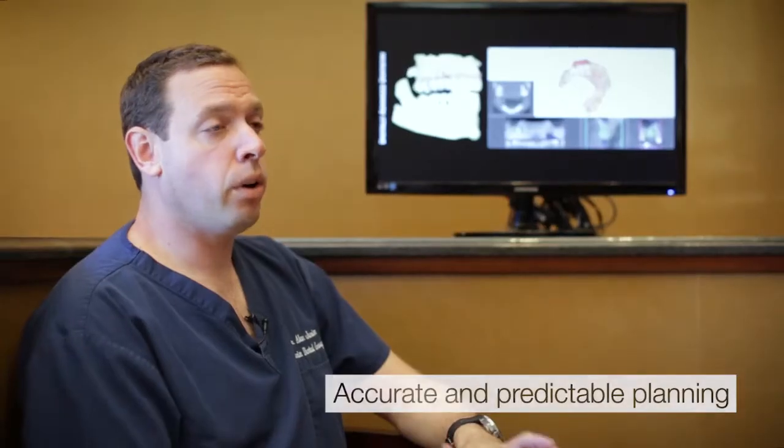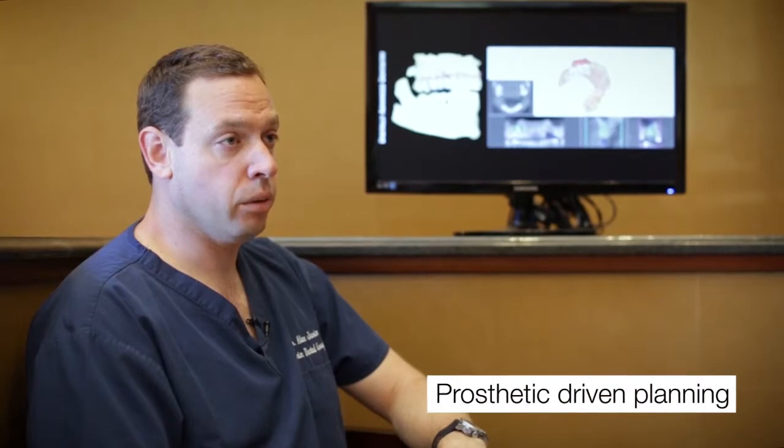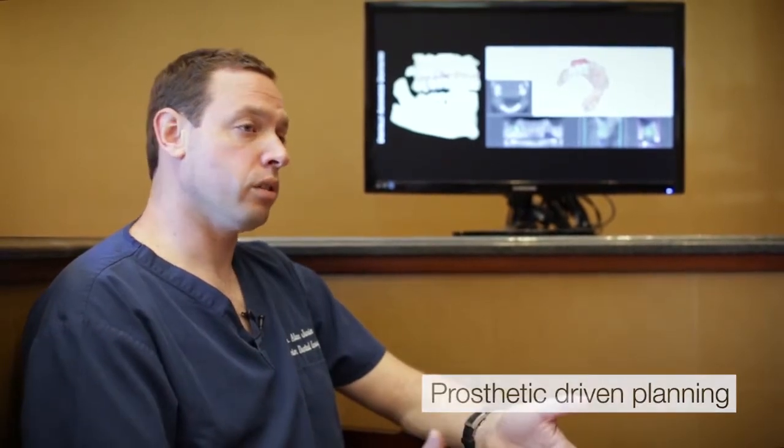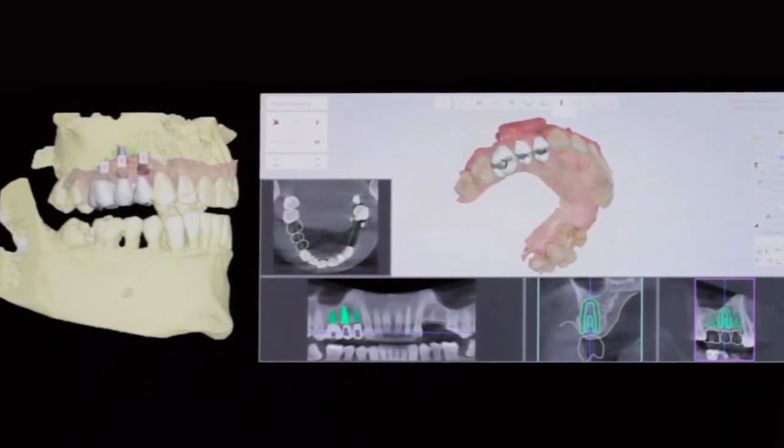A big part to any implant planning is for us to prosthetically plan where we want the implants to go. We want to work in reverse. We want to be able to take our teeth, set up our teeth where we want them to end up, and then put our implants in the position relative to those areas.